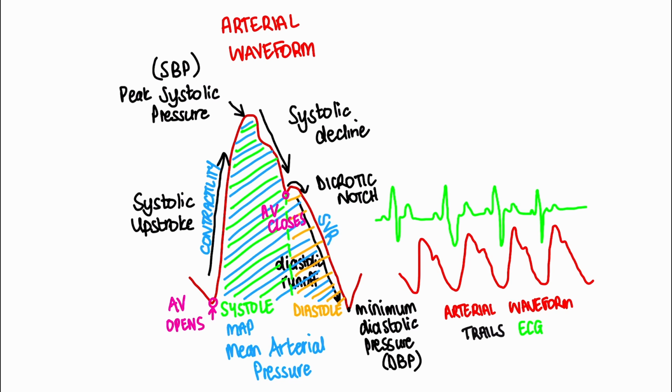Please note the arterial waveform is slightly behind the ECG. The mechanical action is slightly behind the electricity, and our systole, represented by that peak systolic in the arterial waveform, versus our QRS, is behind about 180 milliseconds.